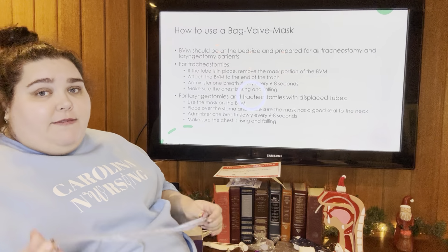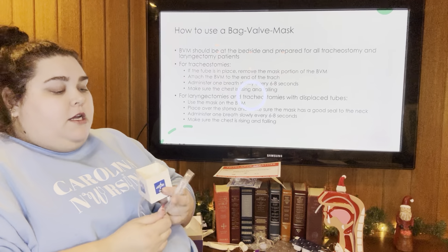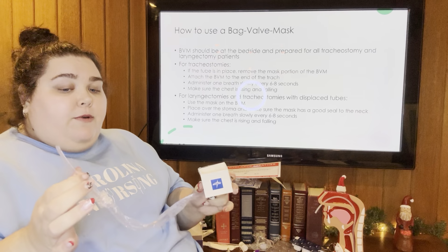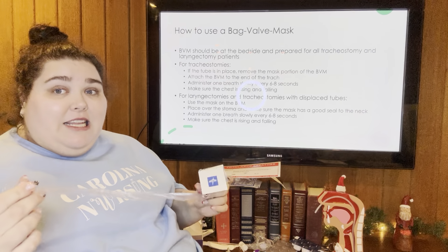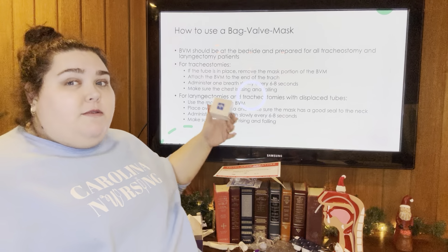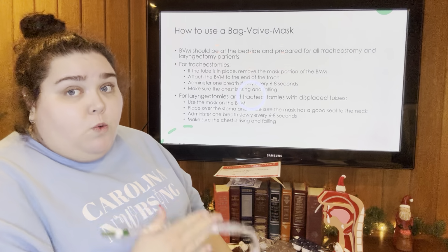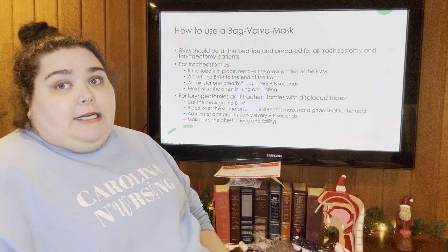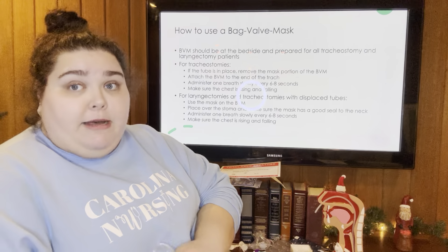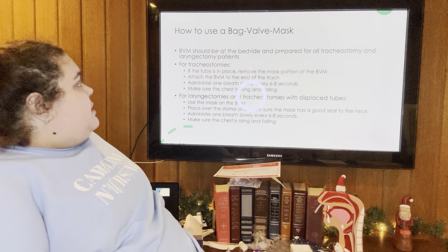So after we have done that suction, we're going to take our little container here and put the suction in here, again occlude, so that we pull up water and don't have anything stuck in the suction tubing. This part is not as important. We want the tubing that's reusable, that's going between the wall suction and this tubing, to be clean. This we're going to throw away after each use. Do not save these, because that is one of my pet peeves when I come in and find these hanging dirty on IV poles and such.